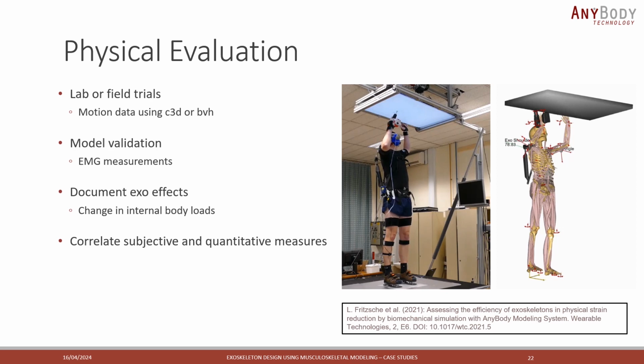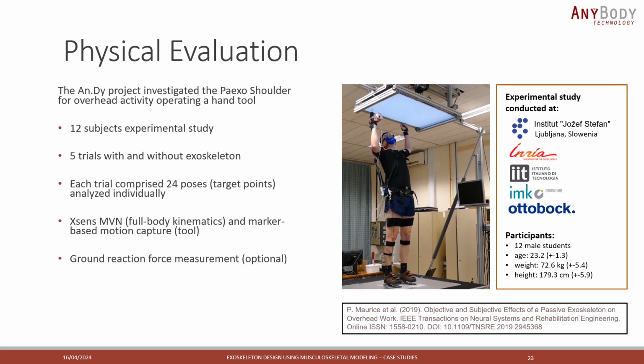Then with the musculoskeletal model and the other measures that you have, you can document the effects of the exoskeleton and how it affects the internal body loads. You can also make some detailed investigations and try to correlate some subjective and quantitative measures.